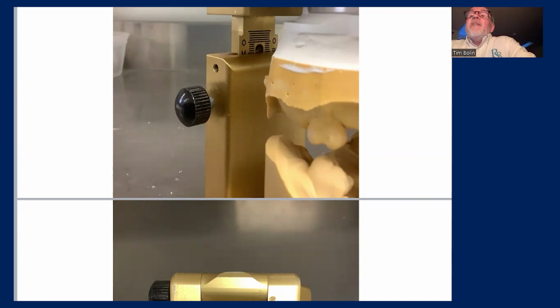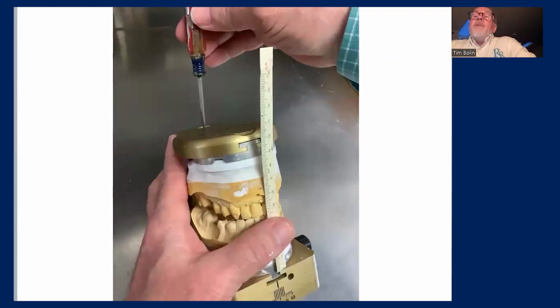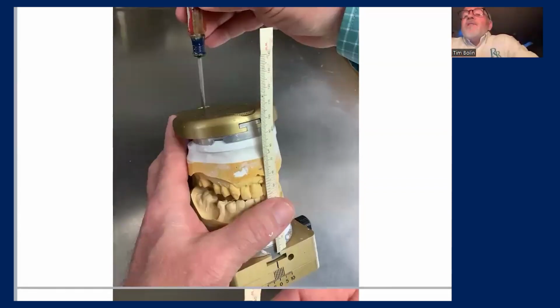We're going to leave 2.5 millimeters of vertical opening on the Acculiner, and then use 2.5 millimeters of rotational opening. On the top of the Acculiner, there's a set screw in the back. Using a gauge or ruler, we're going to open up or rotate the anterior segment of the Acculiner 2.5 millimeters.